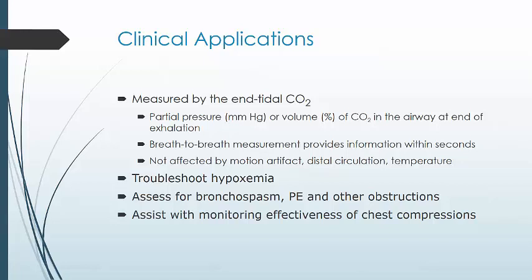This can turn into that hypoxic drive, because the medulla is kind of numb to all the CO2 signals, so they rely on the oxygen. So for this, it can tell you if they still have a normal stimulus to breathe or if they have gone over to the hypoxic drive.